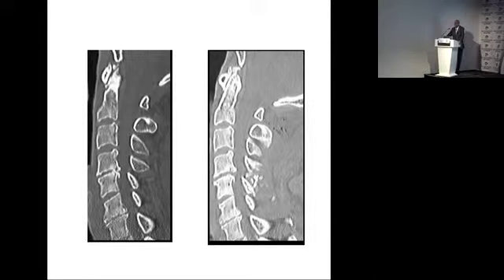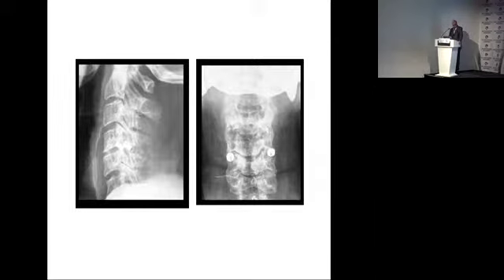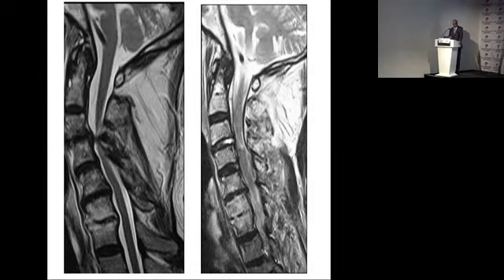Most importantly, clinical recovery can be remarkably effective. So intra-articular spacers can possibly be a revolution in the field of spinal degeneration.